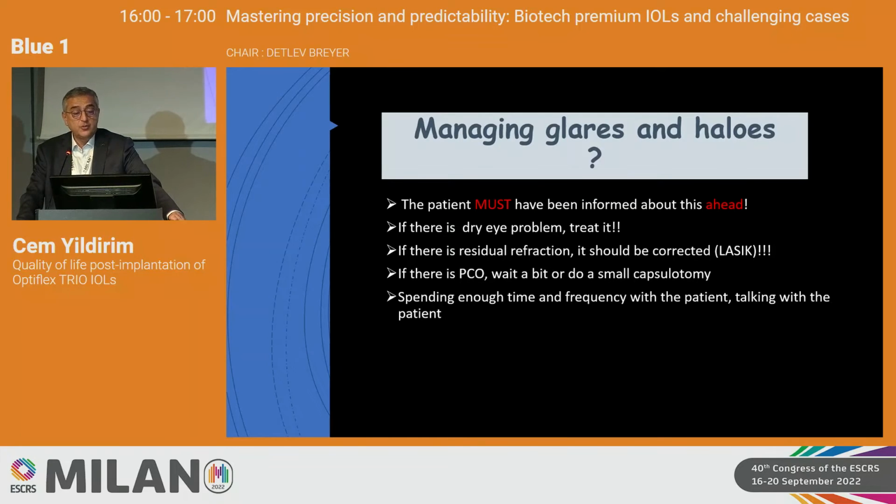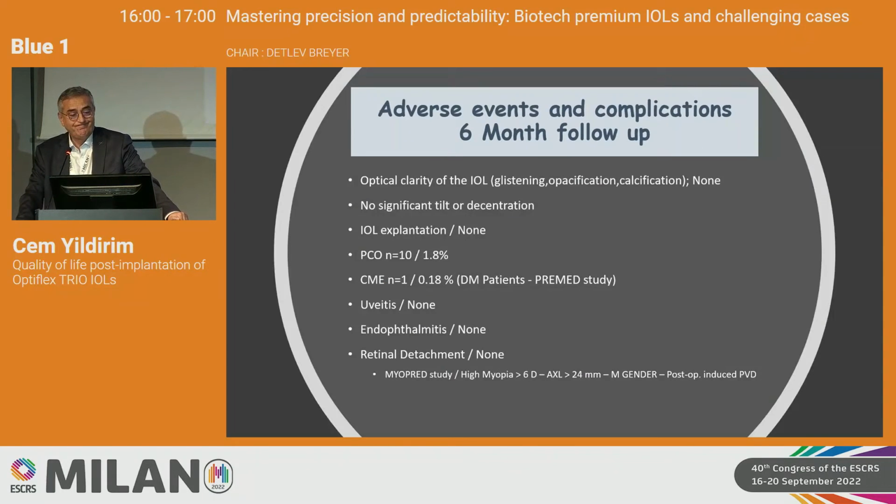What should you do about managing glare and halos? The patient must be informed about this ahead, before the surgery, and you have to select the best candidates regarding managing glare and halos for the trifocal IOLs.